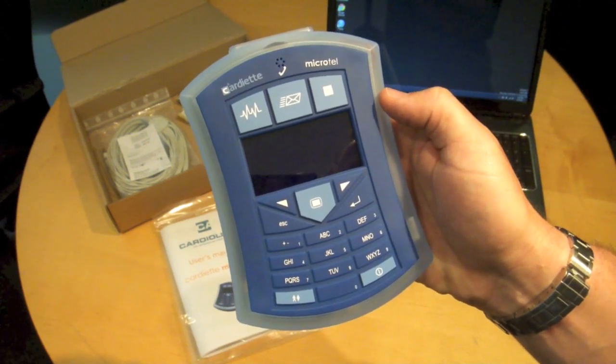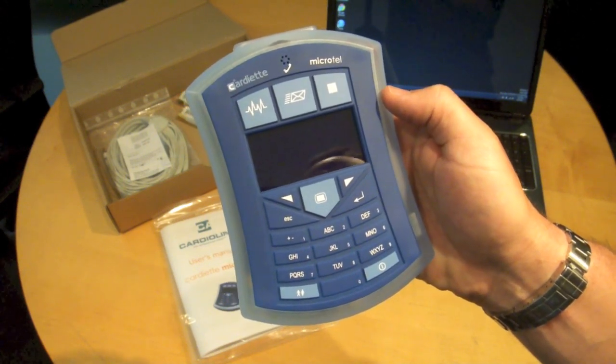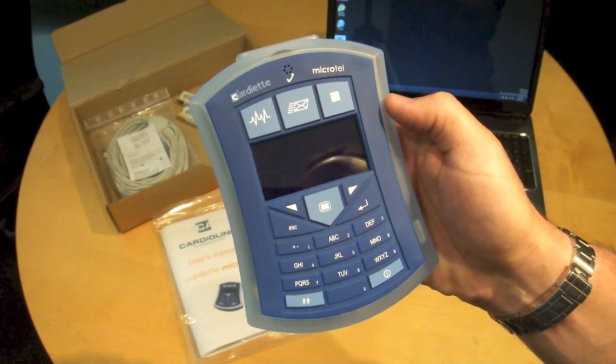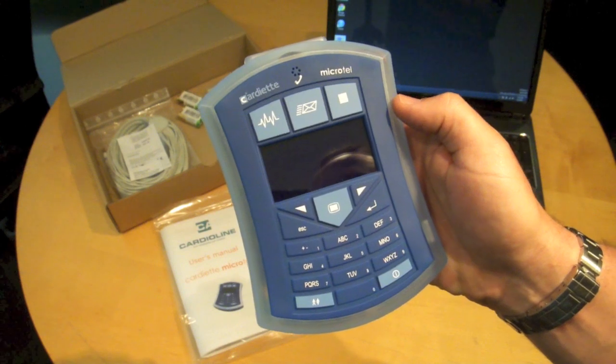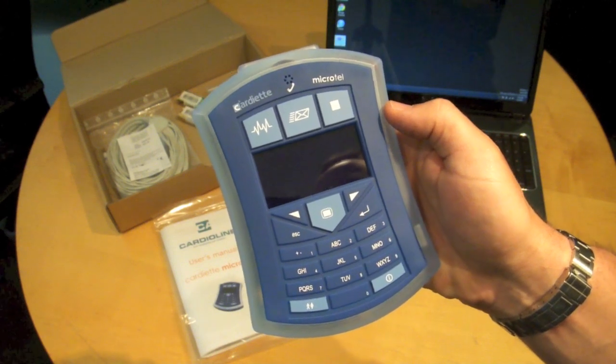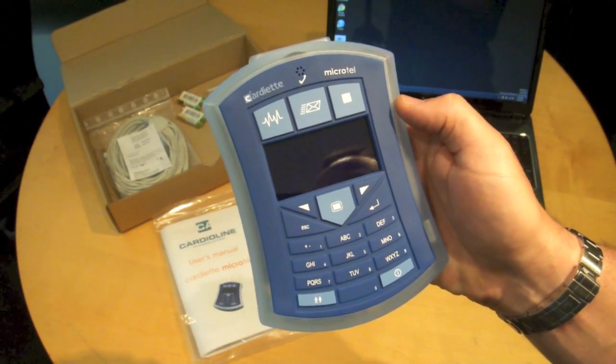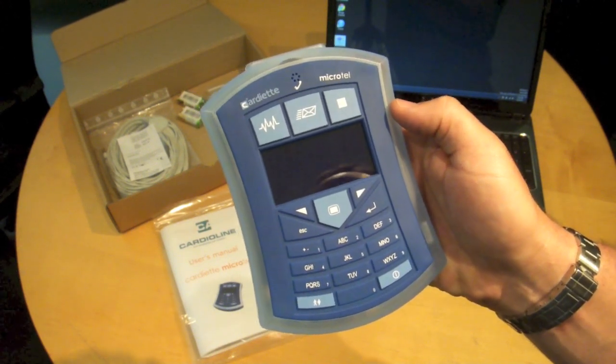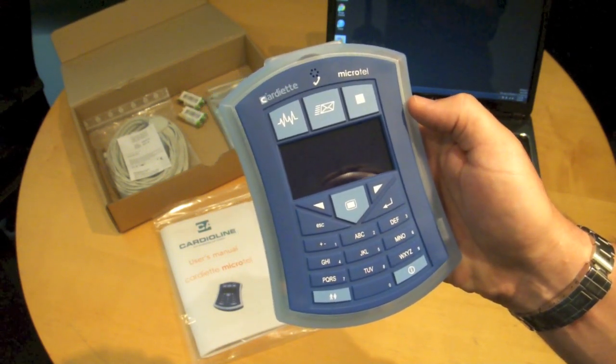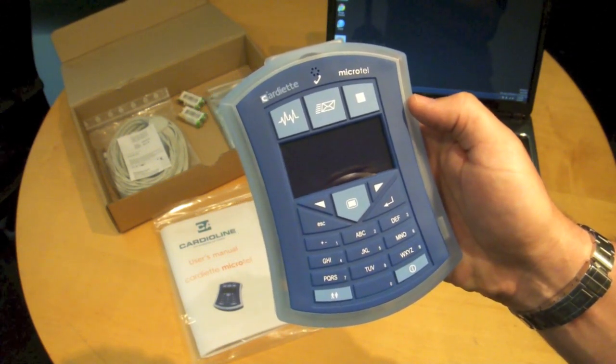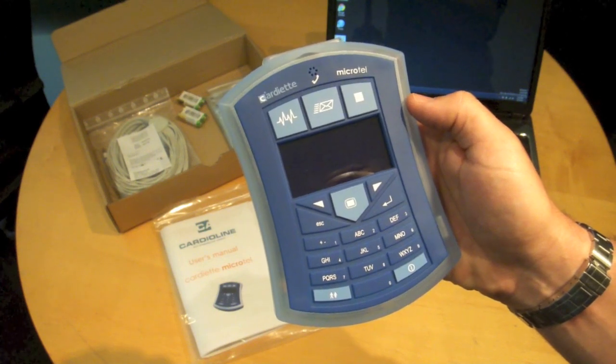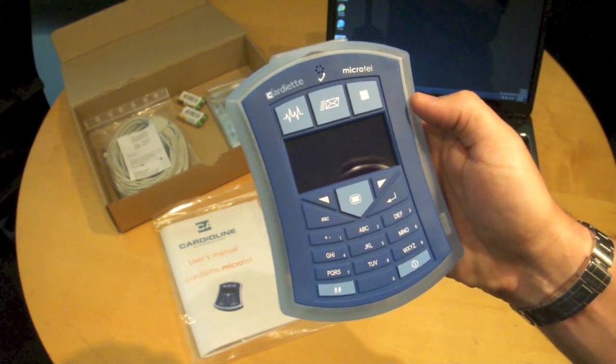You can always of course enter patient data on the software after you've taken the test if you're using standalone mode and prior to taking the test if you're doing so in real time.